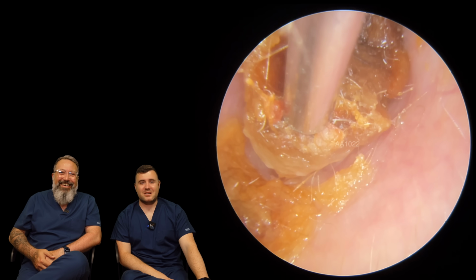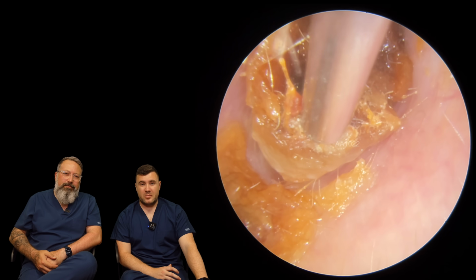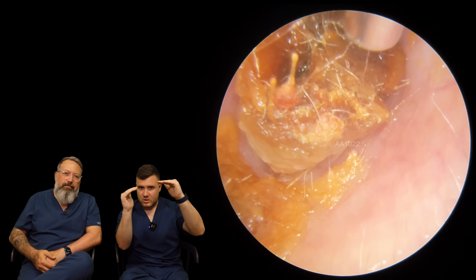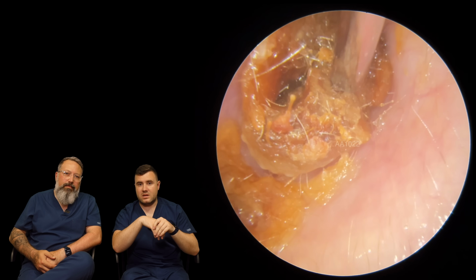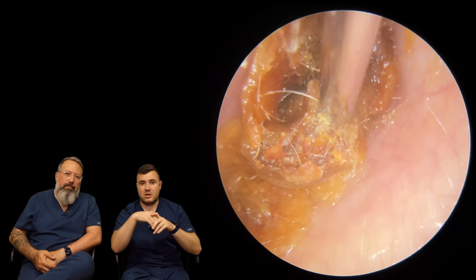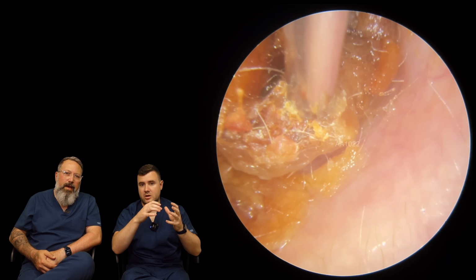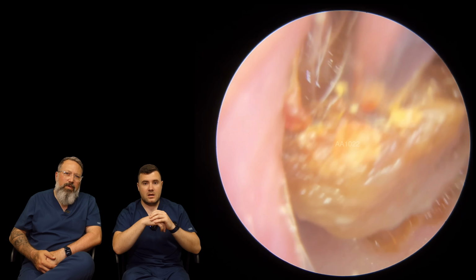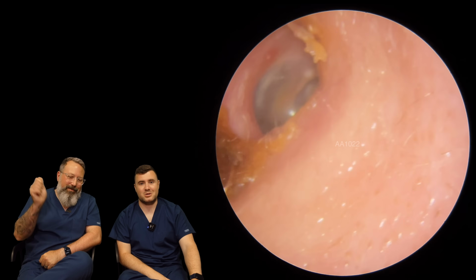So I'm just trying to hold this grip here because it's coming loose, but it's still holding on somewhere. It looks like it's holding on at the roof of the ear canal there. So I'm going to give this a little bit of a wiggle. The patient's absolutely fine through this. We do always check with the patient, make sure they're still comfortable, make sure the noise is not too much, not interfering. Oh, that came away nicely. You can see how dry it was. It fell off.